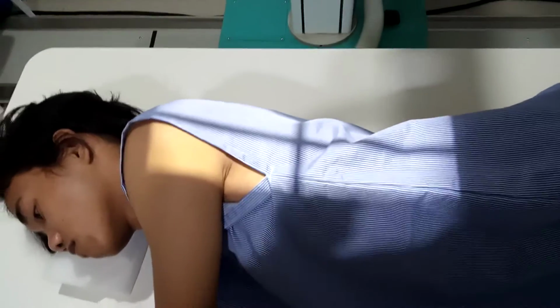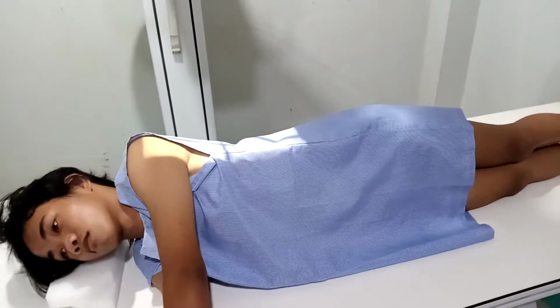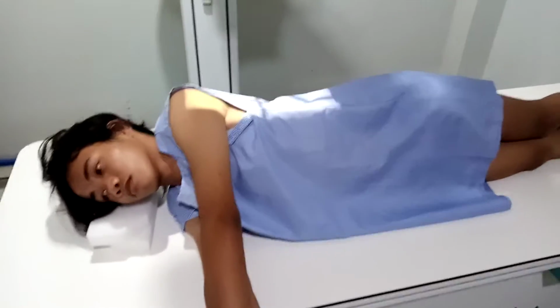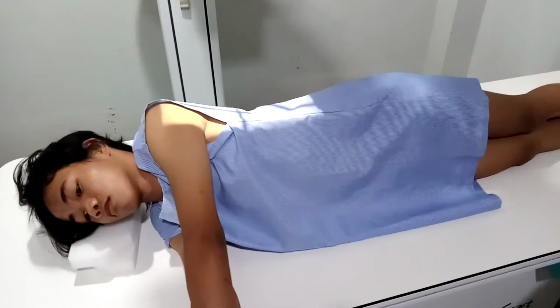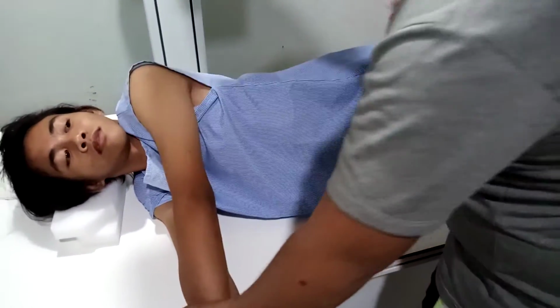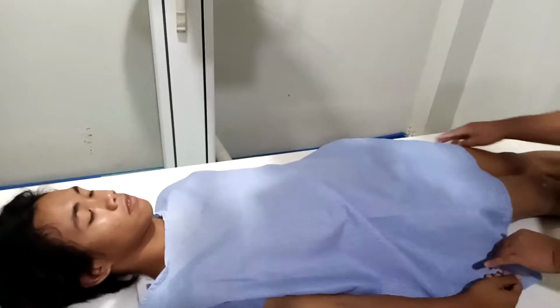The next position that we're going to demonstrate is the lumbar or lumbosacral vertebrae, AP. AP, again, AP, lumbosacral vertebrae. So in patient positioning, position the patient in a supine position. So sir, pag-flip sir, na-after your... that is the supine position.